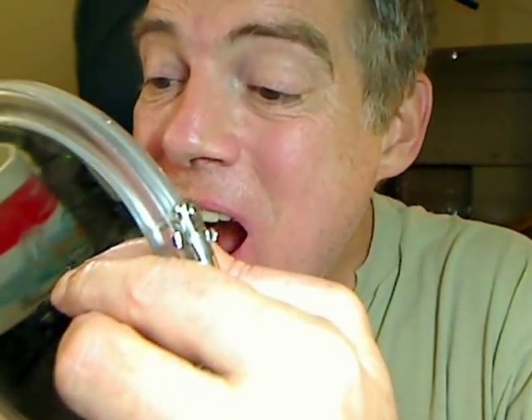I suspect there's an abscess down there — well, let's find out. It's becoming more definitive of what's going on. I don't know the answer; I'm just going to keep going until it's clean. I definitely want to check how sturdy this thing is — it seems pretty sturdy. I'm just coming along with this straight Micro Mini Gracie 1-2. It's nice and straight, very narrow — I can go in very deep. I'll get this line clean. I'm testing the notion of whether it actually did bleed out or not. If it wants to bleed out, I'm certainly making it more able to do so.